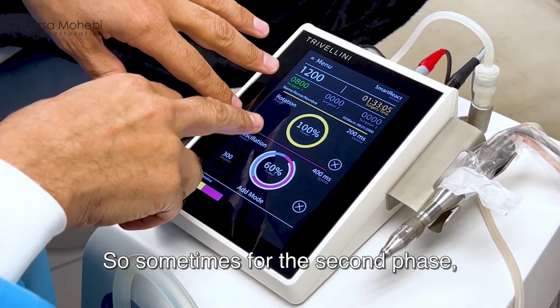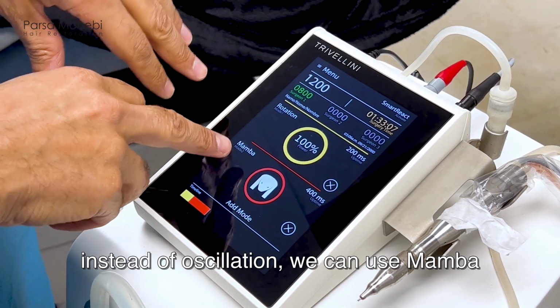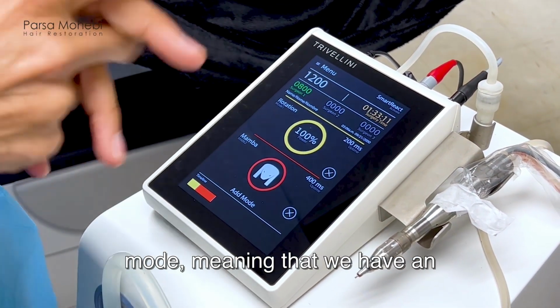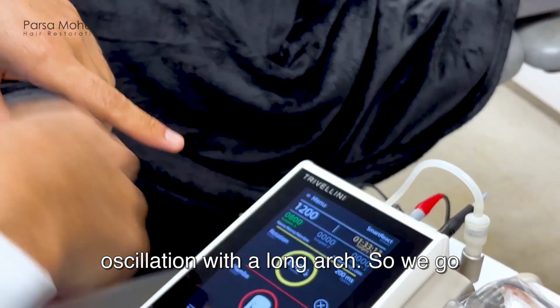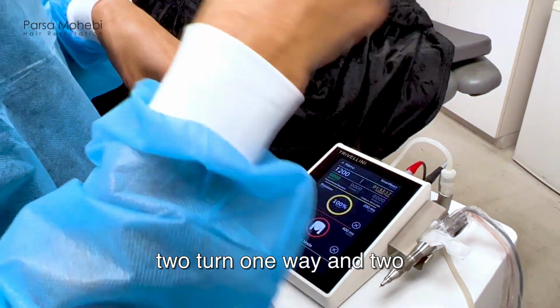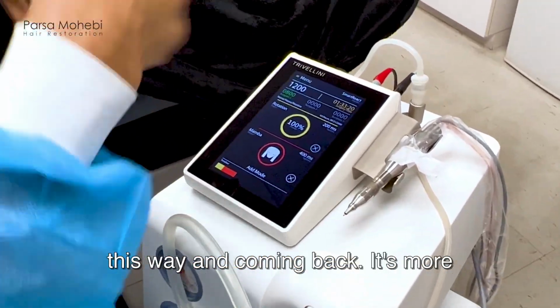So sometimes for the second phase, instead of oscillation, we can use Mamba mode. Mamba mode is a roto oscillation mode, meaning that we have an oscillation with a long arch. So we go two turns one way and two turns the other way. So we go this way and come back.